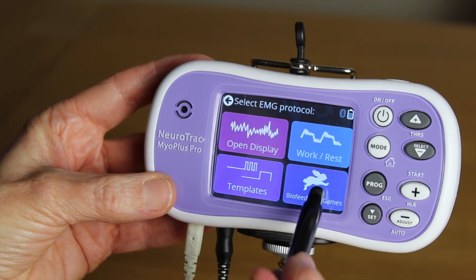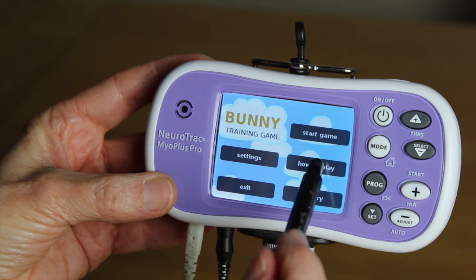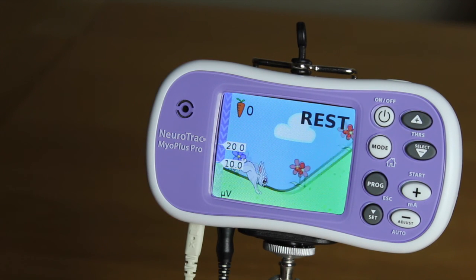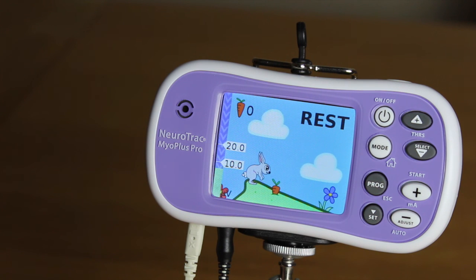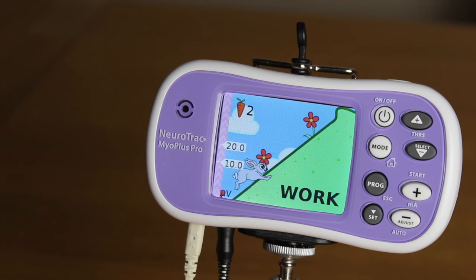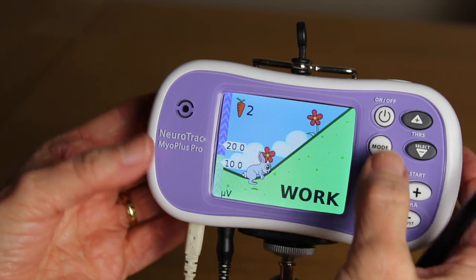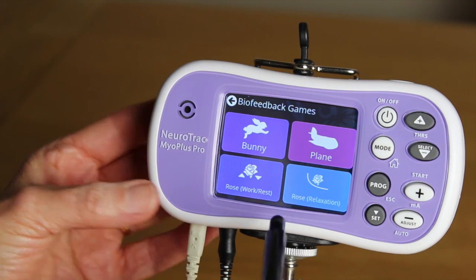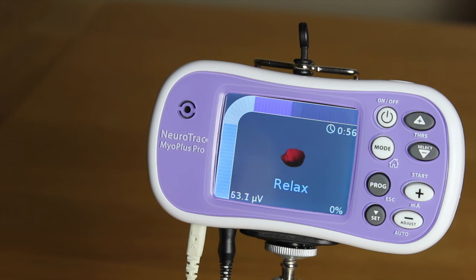Going back to the home screen, we can see there are biofeedback games which can be fun and help compliance, especially in children. Each game has clear instructions and conditions and can help to train muscle strength, coordination, and encourage complete relaxation. The rose relaxation game is especially helpful for women who struggle to relax and release their pelvic floor.